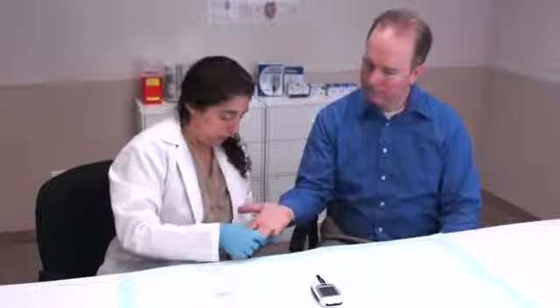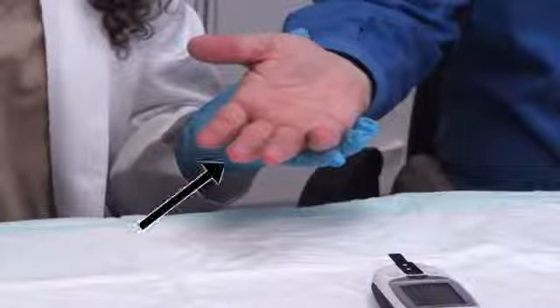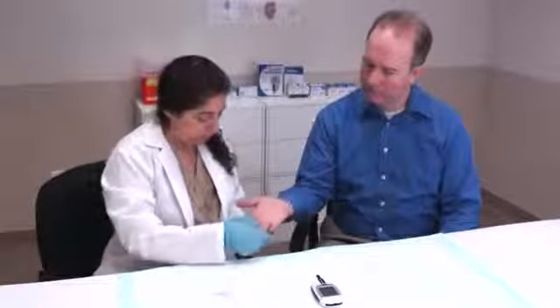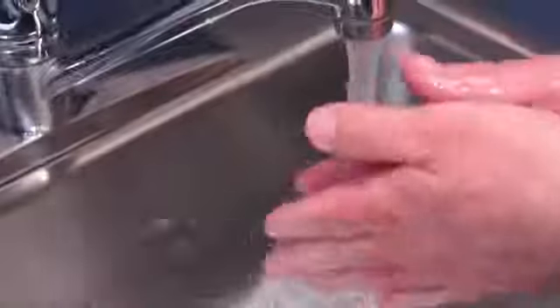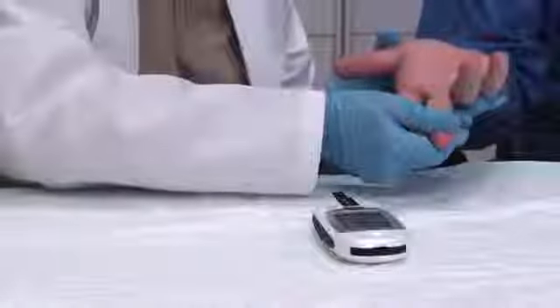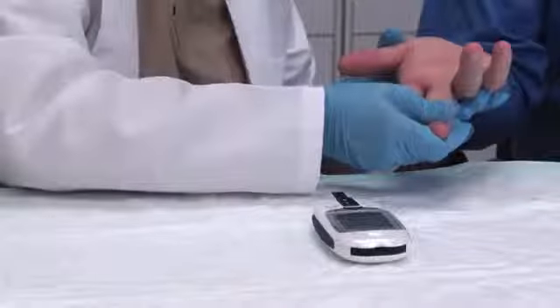Blood collection. Ideally, the middle or fourth finger should be used for blood collection. The finger to be tested should not feel cold. To enhance blood flow to the test area, you can run warm water over the selected finger or gently massage the finger from the lower or proximal portion towards the distal or tip of the finger.